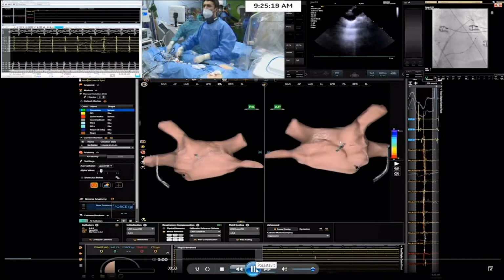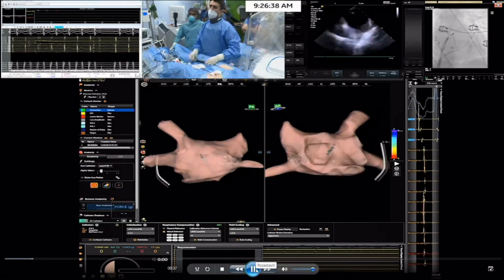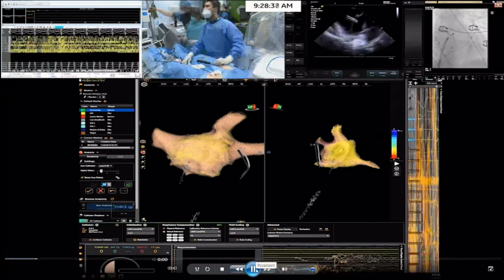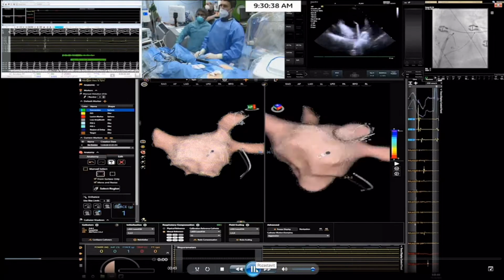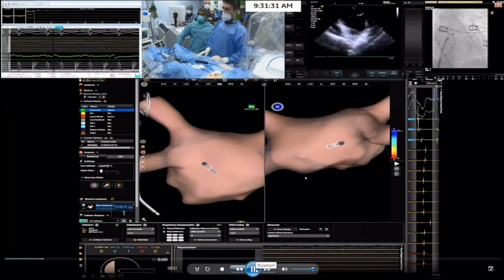Now Honza Petru is performing contact mapping, or rather something like contact mapping, creating the anatomy. Prior to the first lesions, as you can recognize, the case was done not by me but by Honza Petru, Jakub Koruth, who is faculty, and Vivek Reddy as well. So now, after creating the anatomy, maybe we can start.